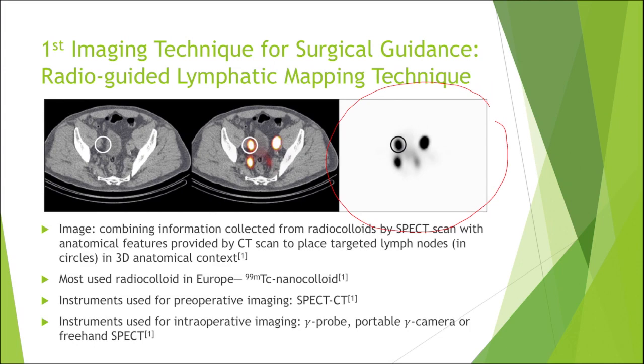However, it has the limitation of being unable to depict the anatomic context in which the targeted SLNs are located. Hence, it is necessary to combine SPECT scan with CT scan. CT scan utilizes a rotational X-ray tube to shoot narrow X-ray beams through the patient's body with X-ray detectors located on the opposite side, which collect data of the internal structures inside the patient's body and process it into 3D images. By combining them, 3D images depicting targeted SLNs with anatomic context can be constructed.